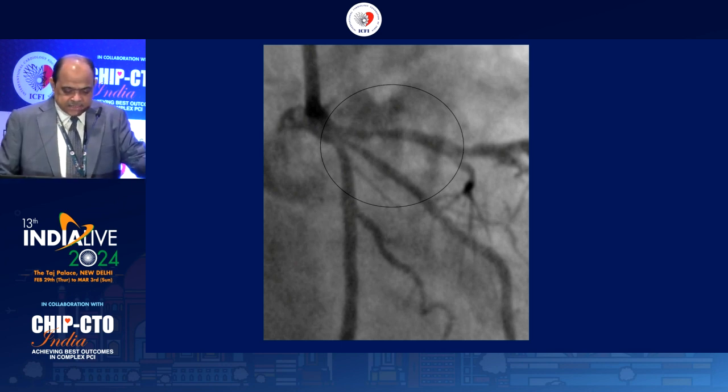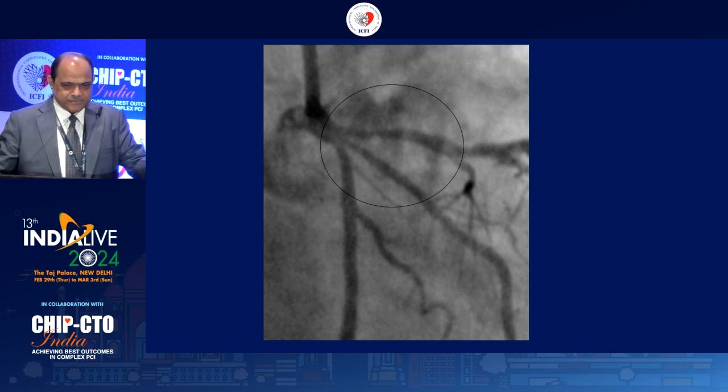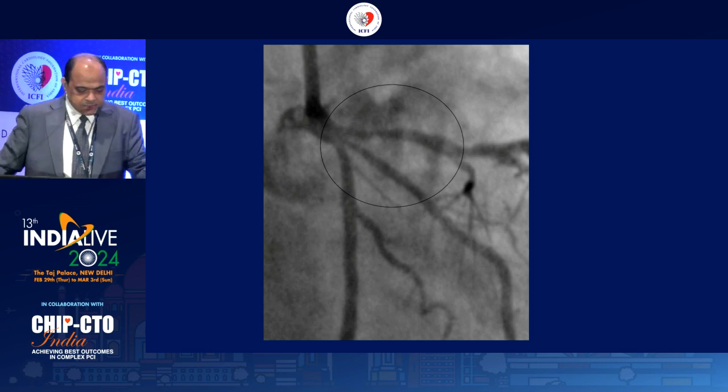But in this case, we decided that we will stent all the three branches. We can discuss why you decided that. No imaging was done. This was because we had non-invasive assessment that the patient has myocardial ischemia. So that will be one point you can ask, sir, why this was not done. I deliberately brought this. Right was normal, so no IABP or no Impella has been put. The access to the left is available.